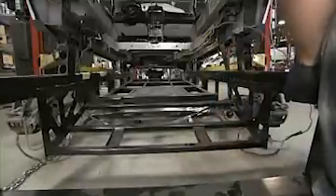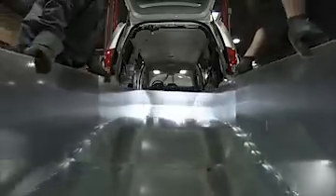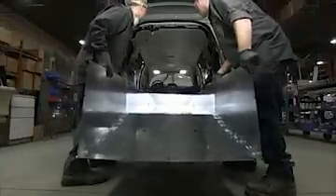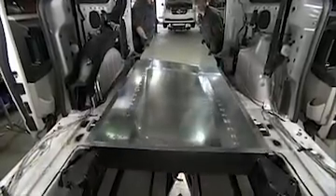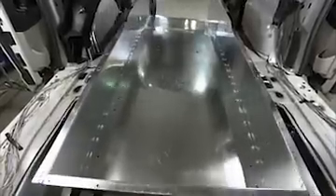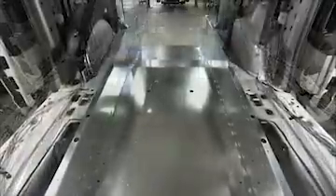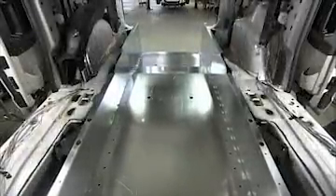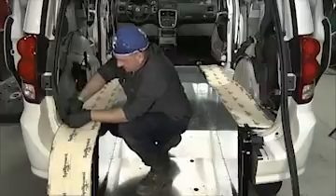This steel structure replaces the original one and is strong enough to support the additional weight of a wheelchair. A motorized one can weigh as much as 4 adults. They slide the new steel floor into the vehicle and lower it into the framework. This new floor is significantly lower than the one the van came with, and it increases the wheelchair passenger's headroom by 30 to 40 centimeters.